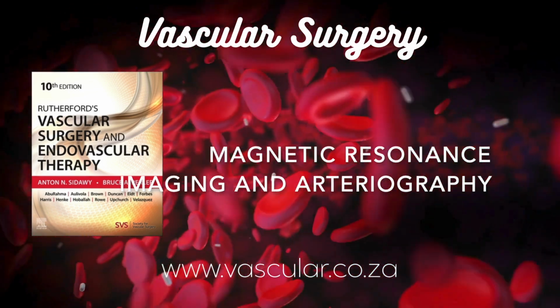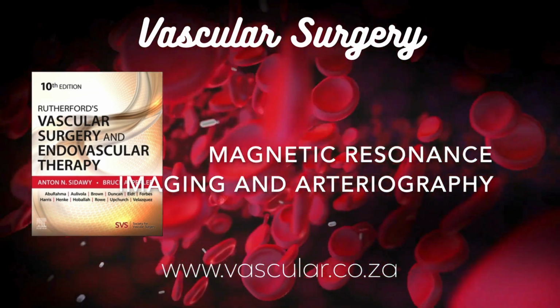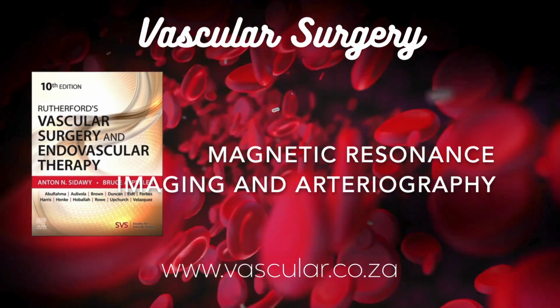Faster is good for MRA. Often, yes. Gradient echo sequences are particularly well suited for MRA because they're more sensitive to blood flow effects and they work really well with the contrast agents. So much of MRA is based on gradient echo.